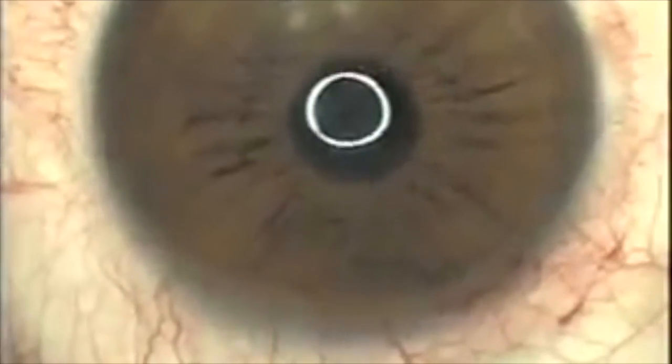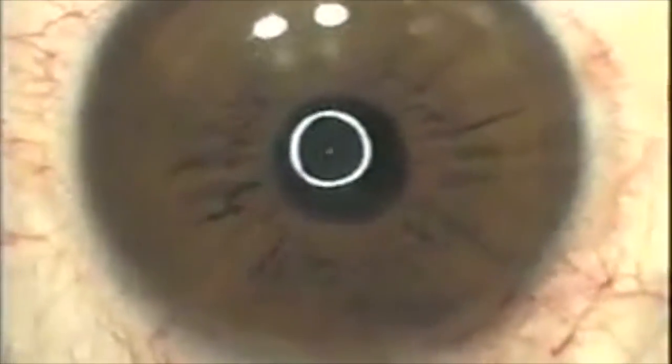And so now the eye patches will be placed onto the eyes and the surgical procedure is basically completed.